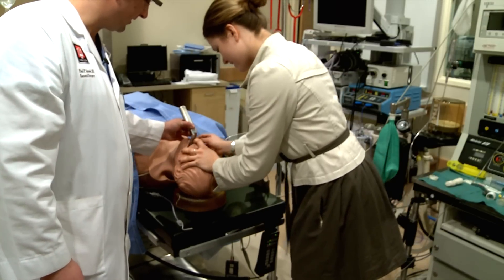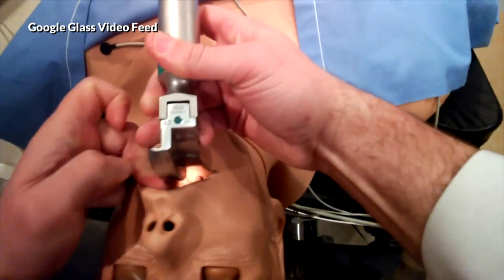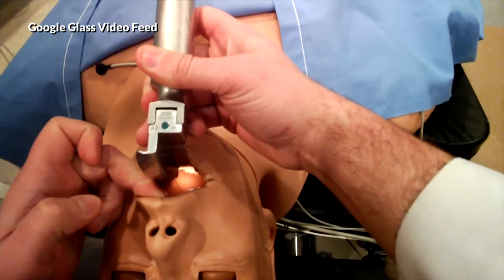Zotek showed me how to insert the tube again, but this time he recorded a video with the Google Glass to show me, from his point of view, how to insert the instrument.